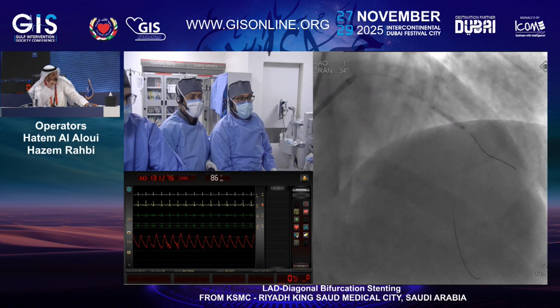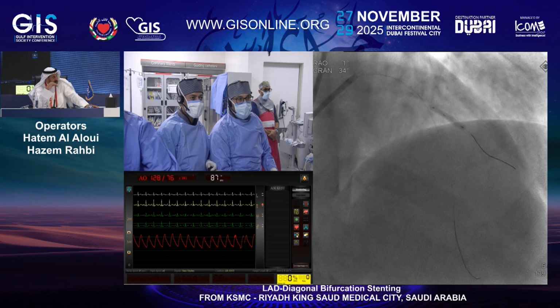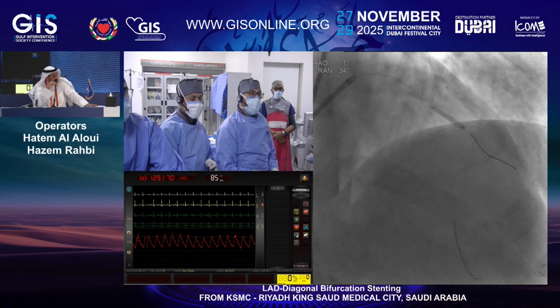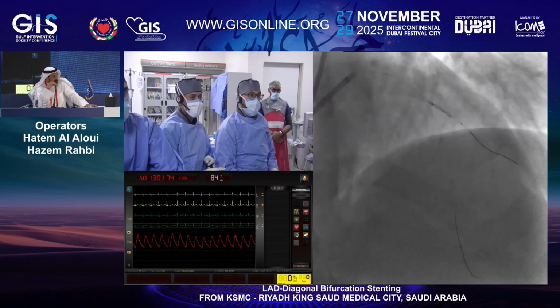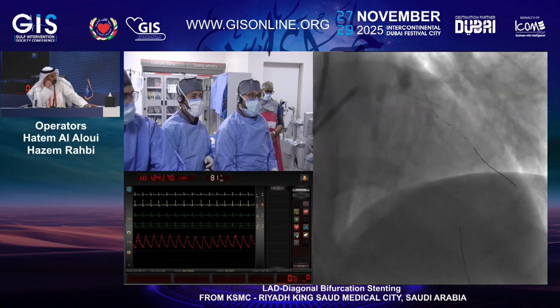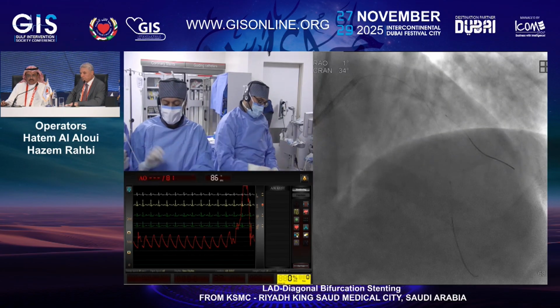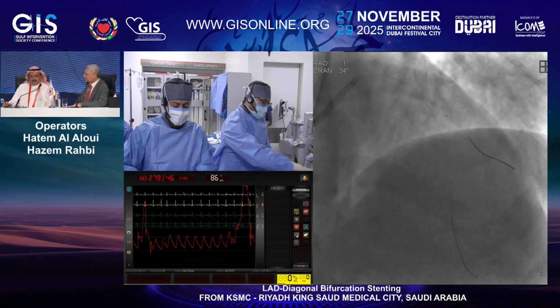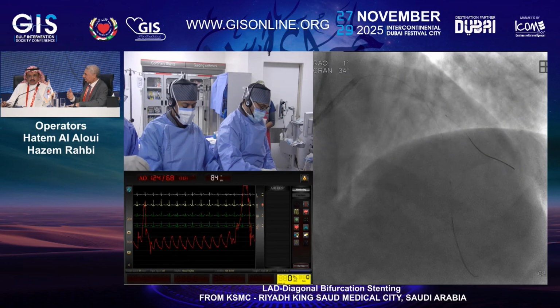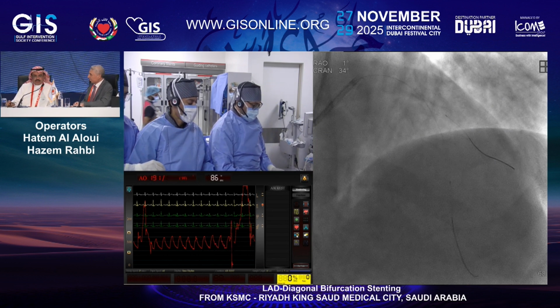Really, these new devices help in preparing the lesion before doing DCB. These scoring balloons, and also there's a grip balloon, you use it 1-to-1 to open the vessel before you do DCB. I think theoretically it makes sense, and it might be beneficial. Now you have to prove that through data and studies, but when you think about it, I think it does make sense.